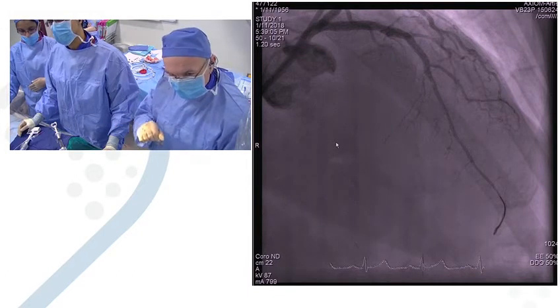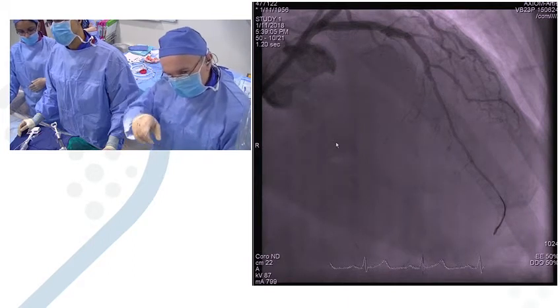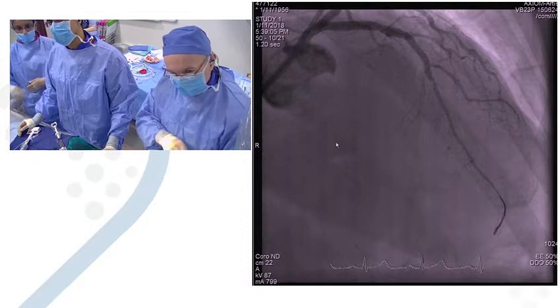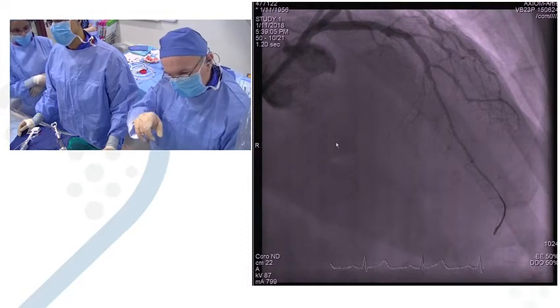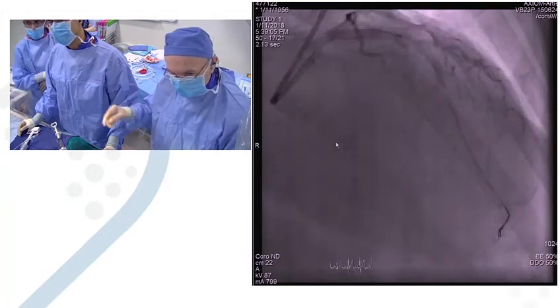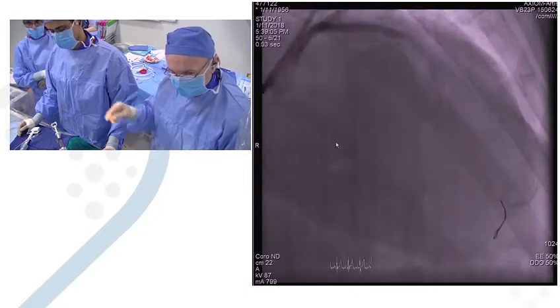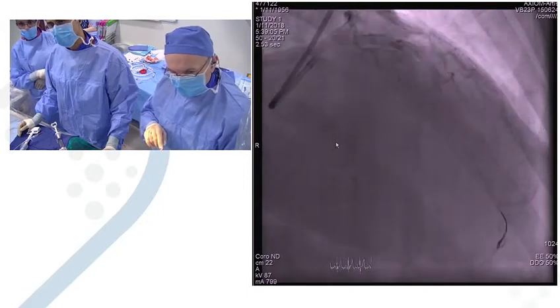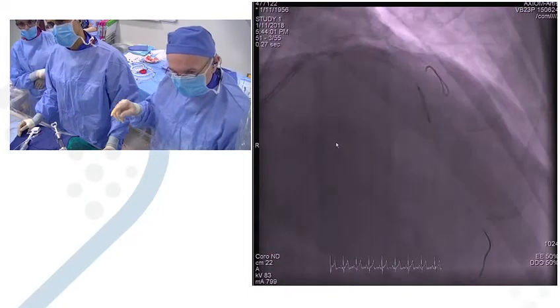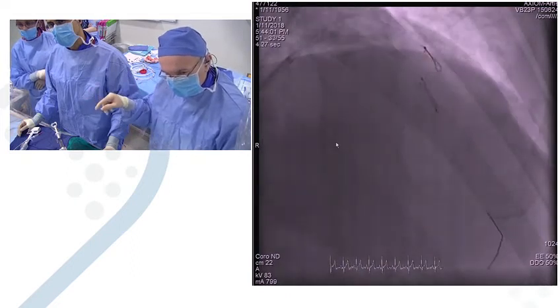And then we post-dilated everything, and then there was one problem. There was a notch here after post-dilatation distal. You see that if you run. And we were doing low-pressure inflation, and finally we ended up putting a small other stent there. In the meantime, Stefan was evaluating, so this is the final stent there, okay?